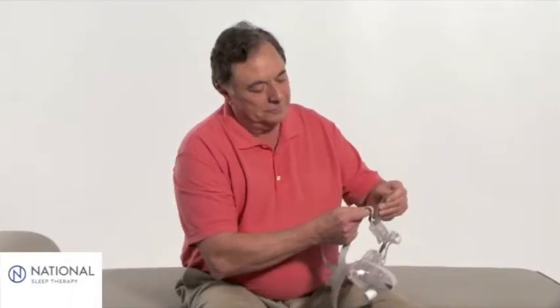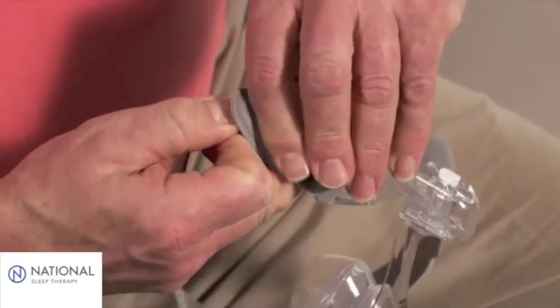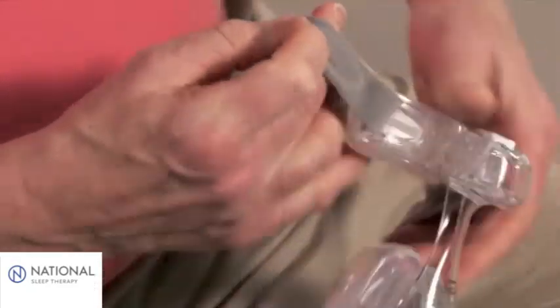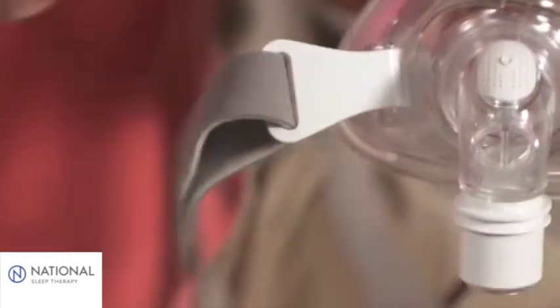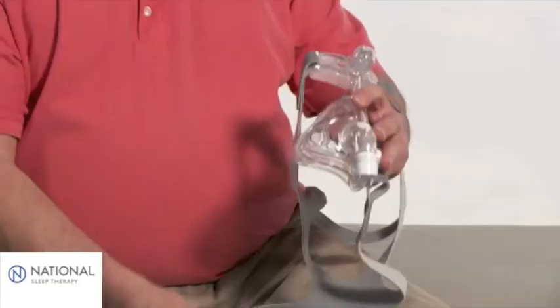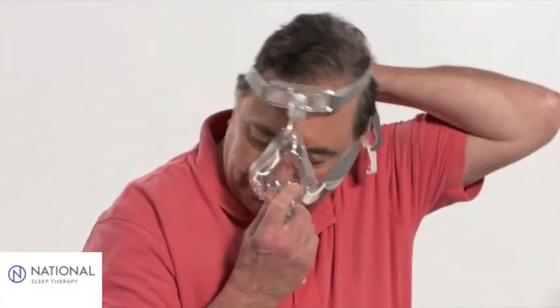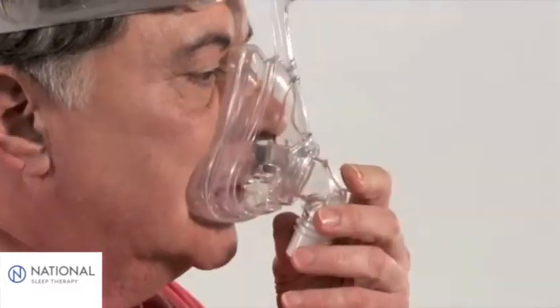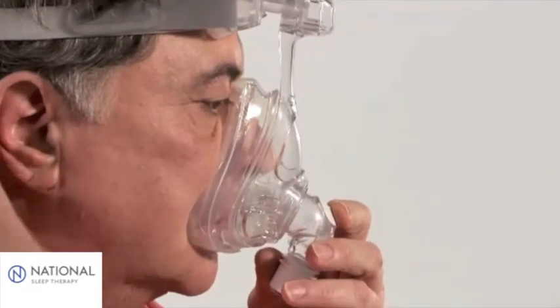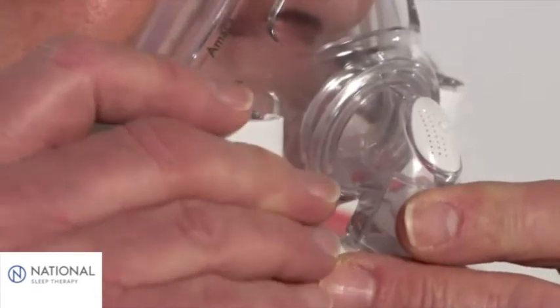To put on the mask, loosen the straps on the headgear to a larger setting. Disconnect one or both of the talon clips by gripping and twisting them away from the frame. Pull the mask over your head, placing the mask cushion comfortably against your face. Be sure your mouth remains slightly open. Holding the mask in position, press the talon clips into place.